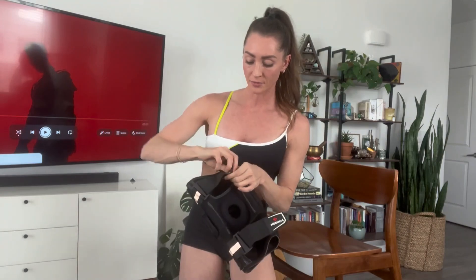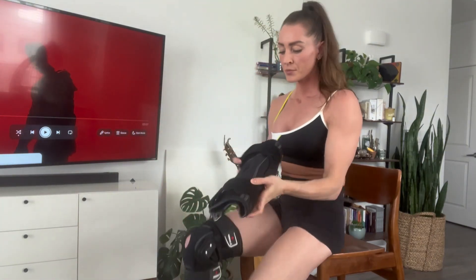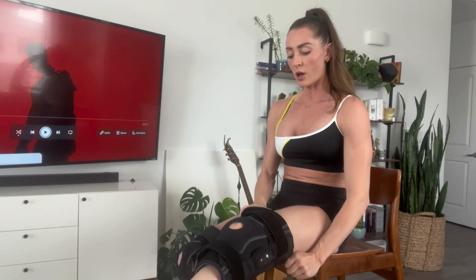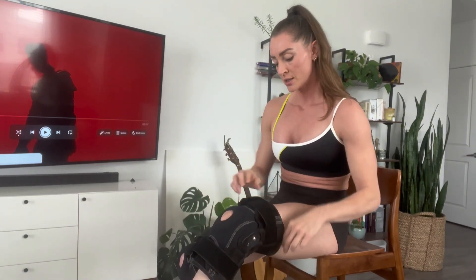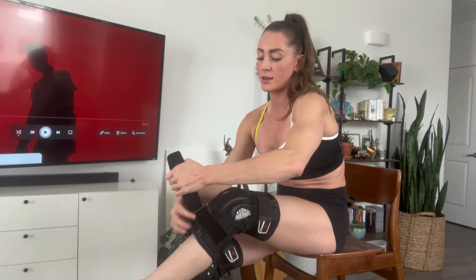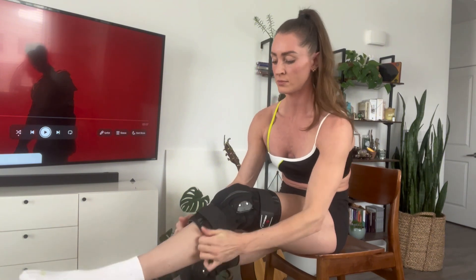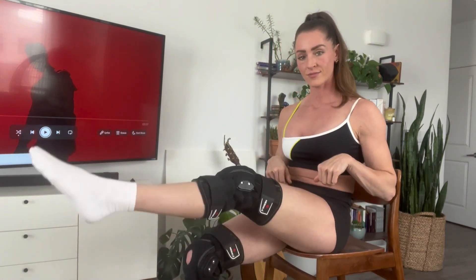I'm going to put it on just so you can see how easy it is to use. You just pull it all the way up until your knee reaches that center. I like to attach the top part first, and then really make it nice and secure on the bottom. Adjust it if needed, and there you have it.